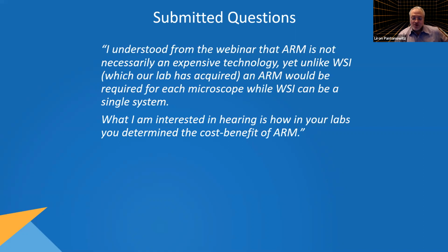Yeah, Dan, I'd like to add that, you know, and you know this probably as well as any other pathologist, not every slide in the world is going to be able to be digitized, right? There are some that you just cannot focus on. They're old slides, they're too thick, they're broken, someone patched them up. There's polarizable material on there that you just cannot handle with digital imaging today. Cytology material people complain about. You may need to put oil on a slide to look at it.